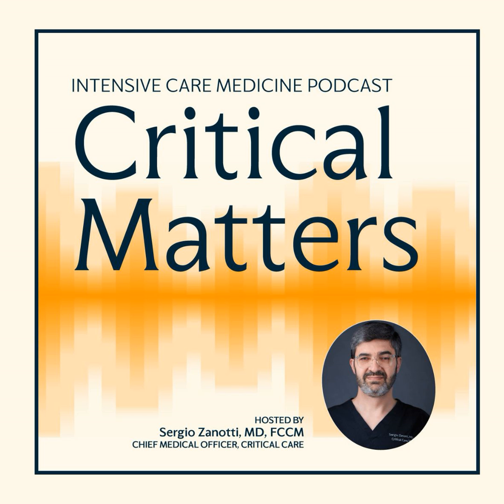Number 2 is to have our nurses or people who are in charge to count down the time that we're interrupting CPR, so we know going down from 10, 9, 8 exactly what's going on. Number 3 would be to make sure that the person doing the ultrasound is the most senior person with ultrasound experience in the room. Like you mentioned, Haney, this is not the time, and it's not fair to our patients to be teaching at this moment.